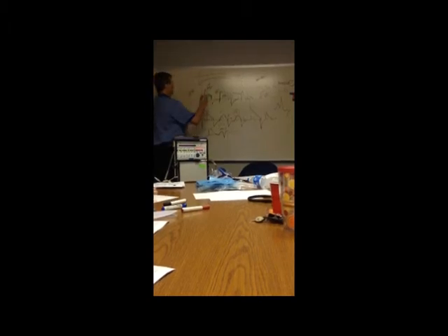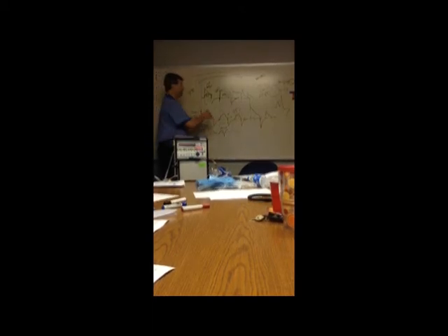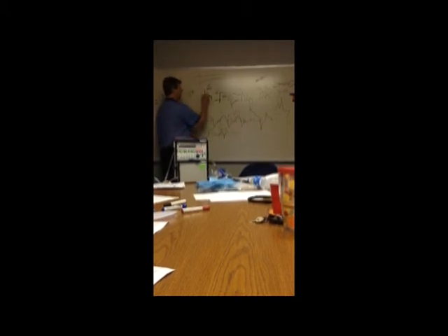Okay? So, there's 3 things in each breath. 2 are constant, 1 changes. Okay? In a volume breath, the amount of air is constant, and the time, or in some machines, the flow is constant.